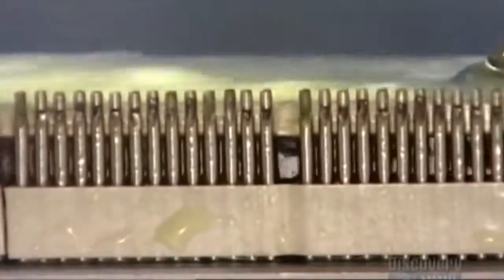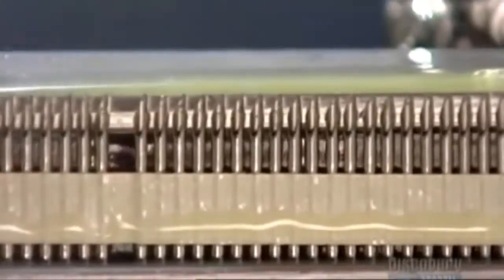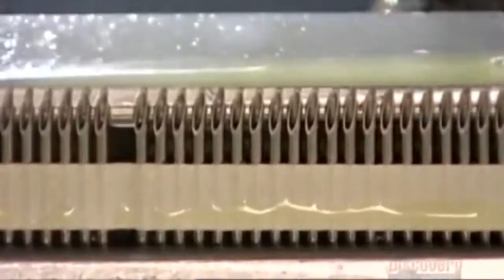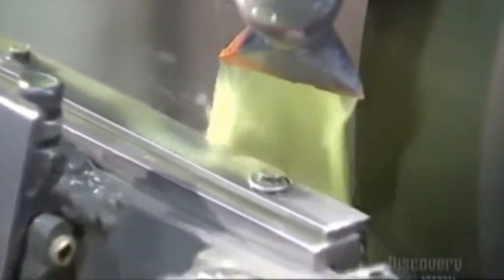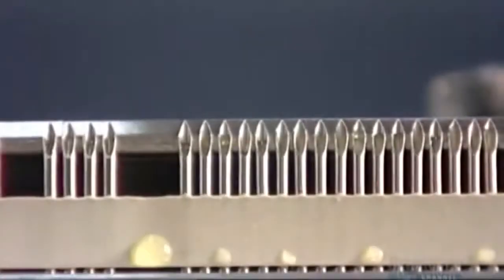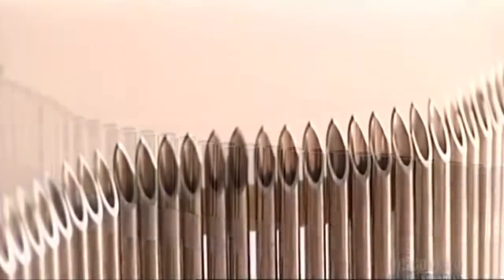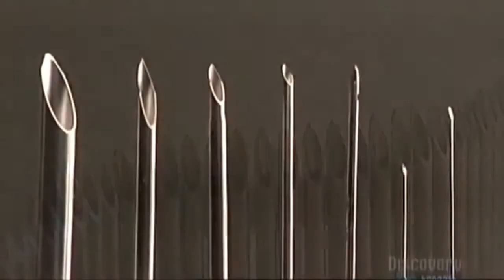Now the fixture rolls and rotates the tubes, then it's back to the grind. The angle of the wheel is changed so that it sands the sides of the tubes. These two secondary grinds sharpen the tubes into a finer point. This is how they looked before grinding, and this is after, with their sharp needle tips.